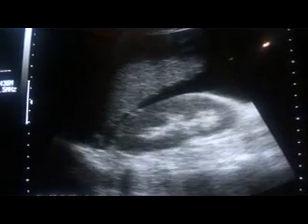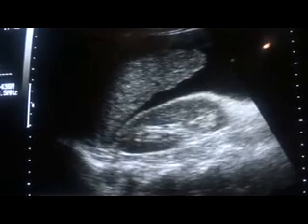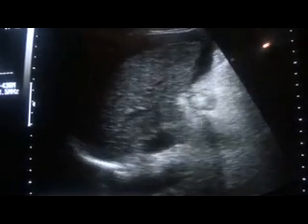Now, after seeing this, here you will see the uterus. Now, this is the uterus, which for the age of the patient is postmenopausal, with a history of bleeding again after a pause of some years.